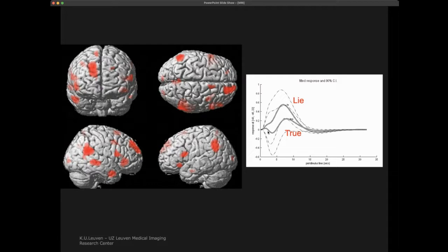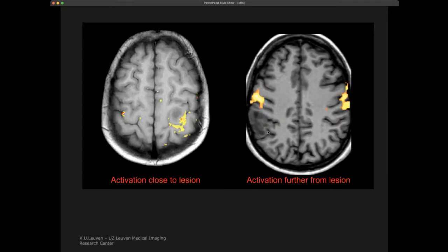So the principle is, indeed, we can look at differential activation of different parts of the brain, and these are different depending on different tasks or different ways we use our brain. We will see that the local oxygenation will be different, and theoretically we can measure this with an MRI scanner. Practically it is something else, but at least the theory is there.